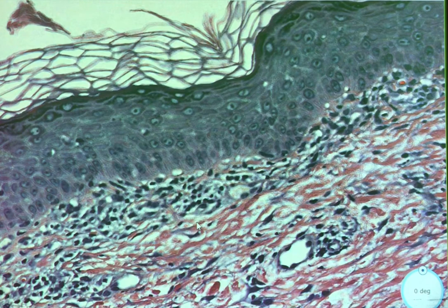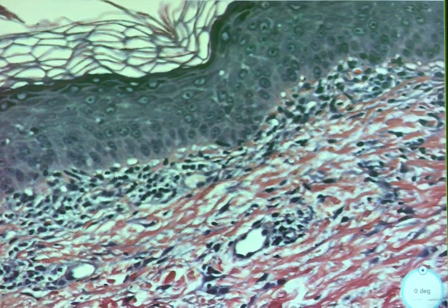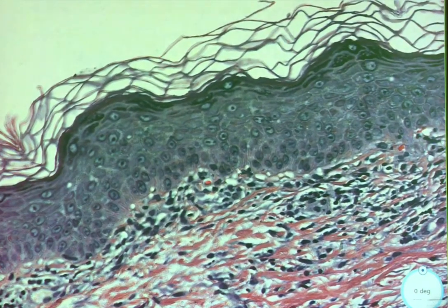Does our senior want to help her out a little bit? Well, it's just the basal layer doesn't look right. It's bigger. It kind of looks like it's jutting out a little. Okay. Yeah, and it's kind of atypical. It looks like they're pushing upwards, but not in the normal way. So there are these little buds almost. Okay.